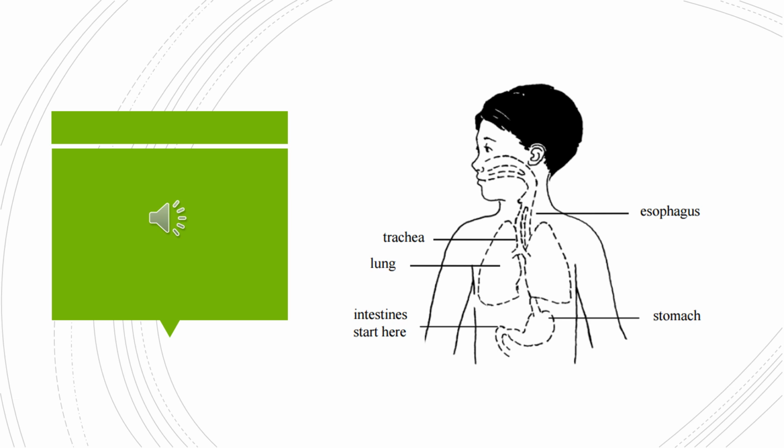A gastrojejunal feeding tube, or a GJ tube, is a combination device that includes access to both the stomach and the jejunum, or the middle part of the small intestine. Typically, tubes are placed in a G tube or stoma, with a narrower, longer tube continuing through the stomach and into the small intestine.